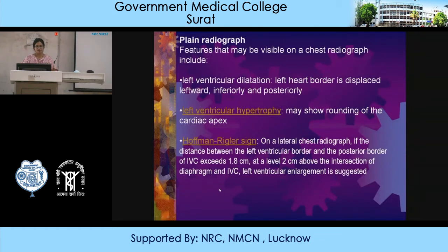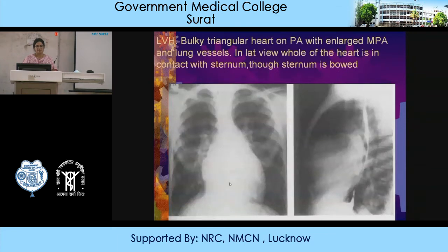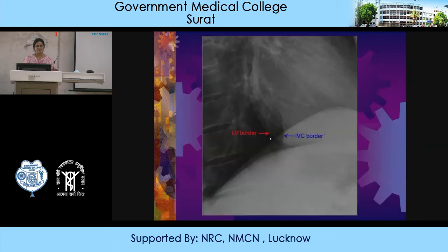You can see a bulky triangular heart on PA with an enlarged main pulmonary artery. On the lateral view, all of the heart is in contact with the sternum. The left ventricular border is situated here; the IVC border is here — there is an increased distance between them, indicating left ventricular hypertrophy.